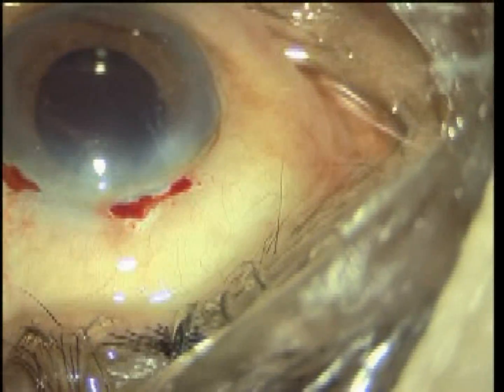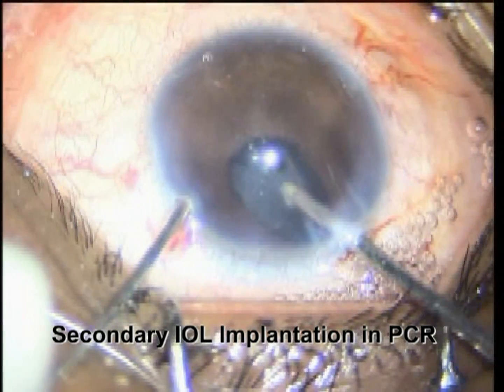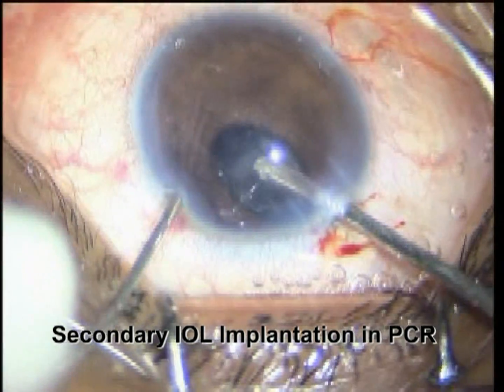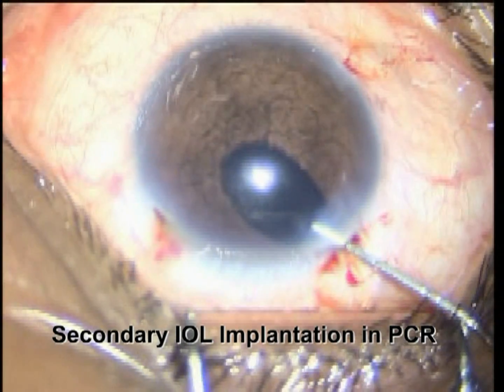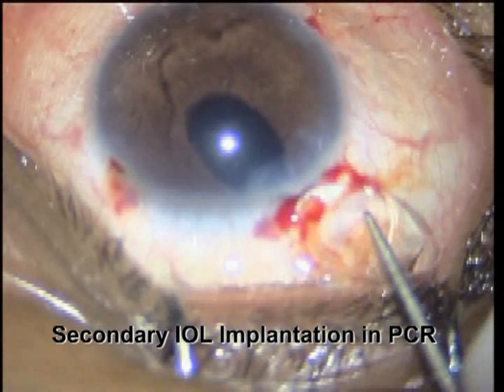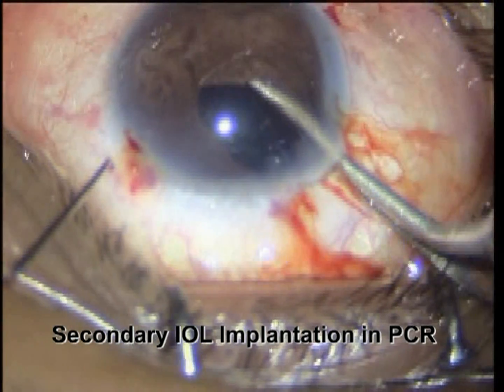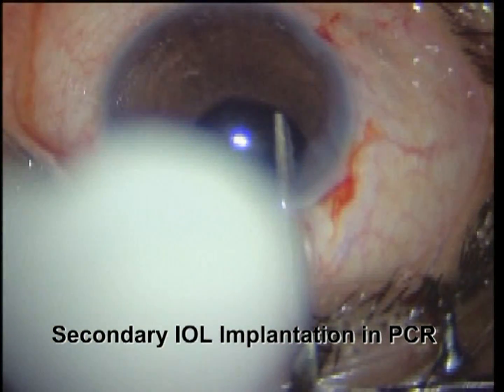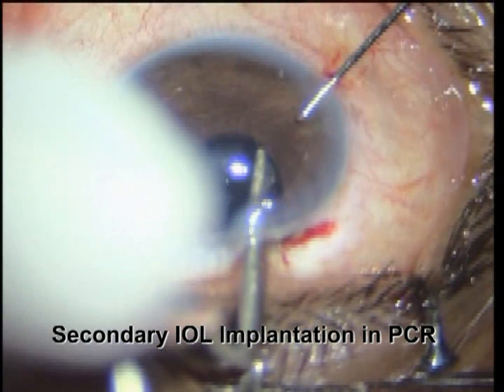We can see a well-formed chamber and a well-centred lens. This case shows secondary IOL implantation in cases of posterior capsule rent. Under cover of triamcinolone, anterior vitrectomy was done. After thorough vitrectomy, the incision was enlarged and an iris claw lens was retrofixated. The clipping was done using a Sinskey hook, and thus this posterior capsule rent case was very well managed secondarily.